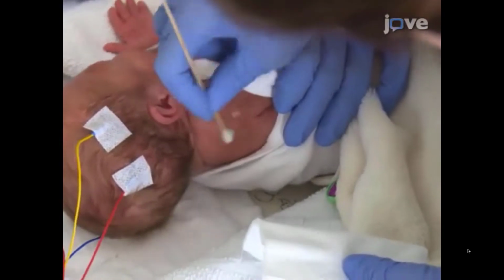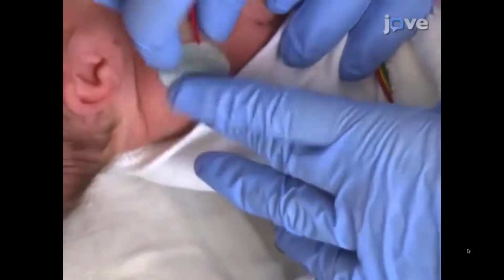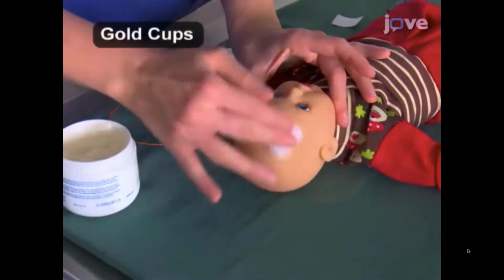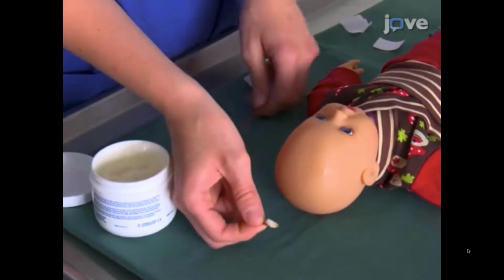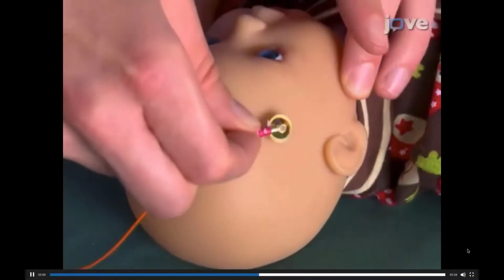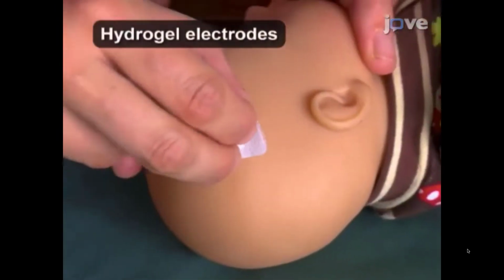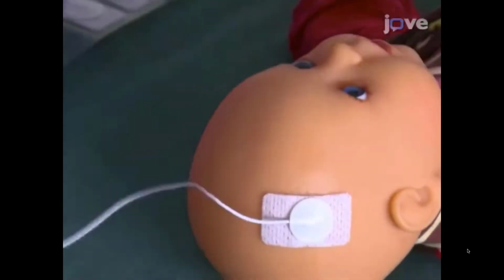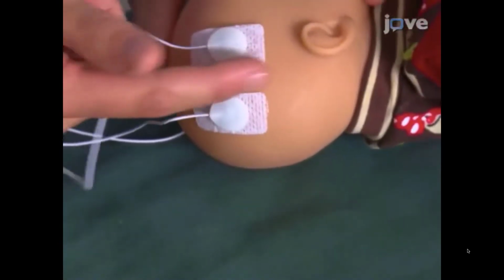If the impedance of the reference electrode, gold cups, or hydrogel electrodes is not satisfactory, perform a few strokes with the cotton swab under the corresponding electrode. If using gold cups, fill each cup with contact gel. Place the cup in the proper position with the cable running towards the head end. Tape it into place. Alternatively, if using hydrogel electrodes, place the electrodes with the cable running towards the head end. Ensure that all electrodes are in place and that there is no mechanical contact between electrodes.